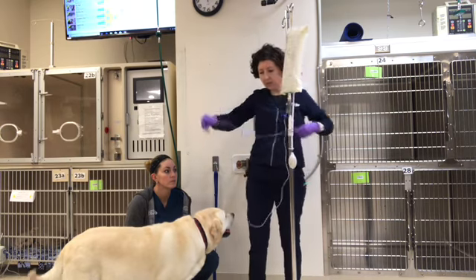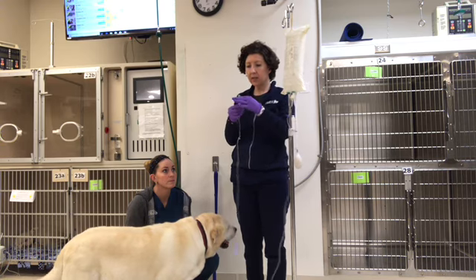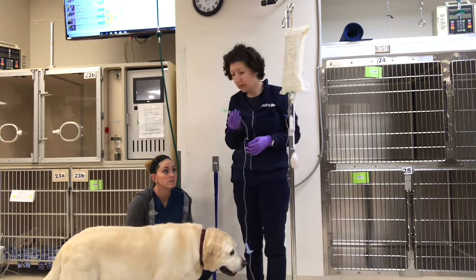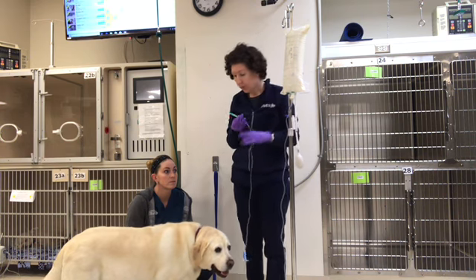I've got my IV line here. It is primed with the fluid. This is a new 18 gauge needle. We use the 18 gauge because it's bigger, so we can get the fluids in quicker.